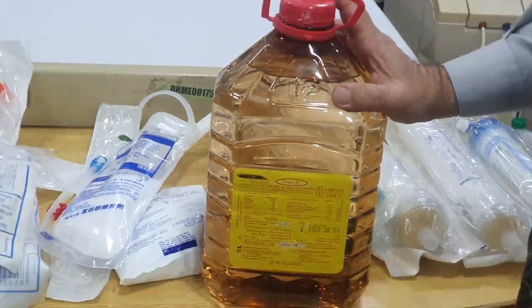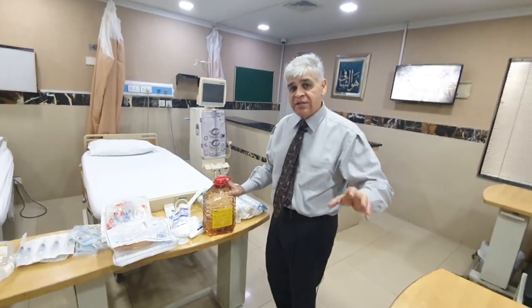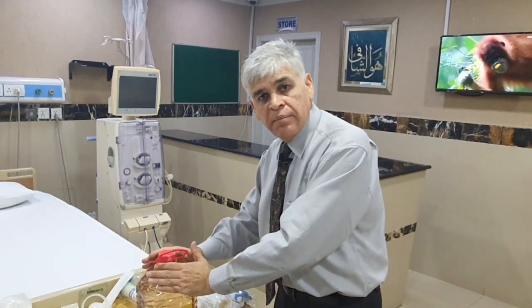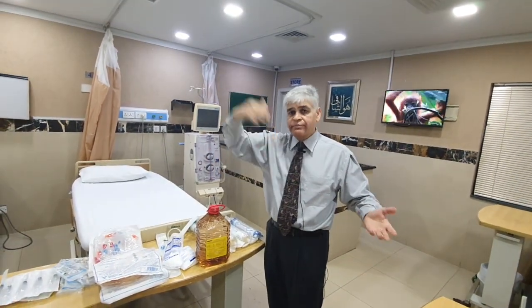Another important thing to remember is, in a dialysis session, 60% of blood sugar fluctuates. So you can lose 60% of your blood sugar. It's just a matter of simple diffusion. Things will move from a higher concentration to a lower concentration. If somebody's got a blood sugar of, say, 200, and you haven't got any sugar on the opposite side, then when this person is connected to a dialysis machine, the person will lose that sugar, because it's simple diffusion from a higher concentration to a lower concentration.